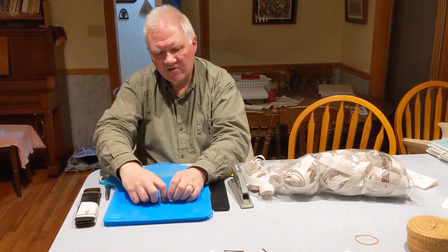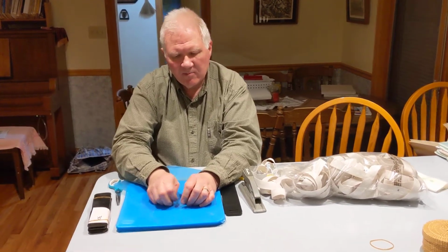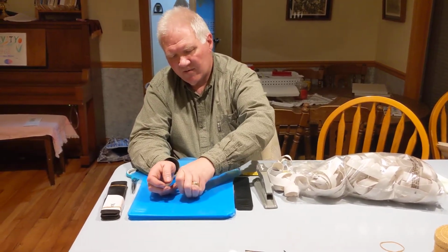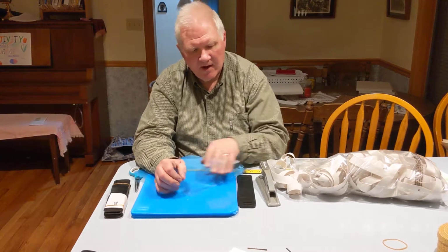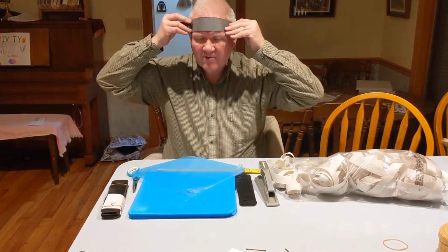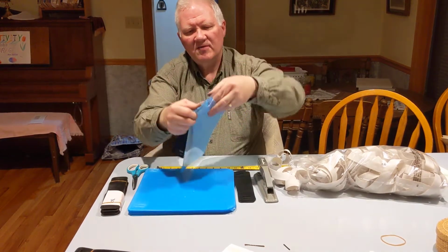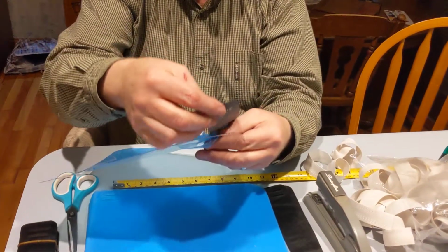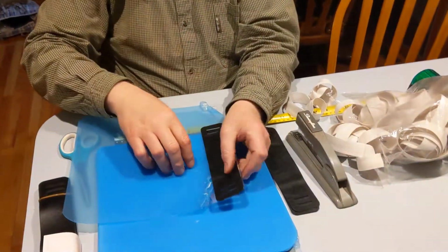So getting those four corners started could be one step of the process, and then the next step will be to assemble with a piece of elastic and a piece of vinyl naugahyde, which acts as a headband. So the headband piece will go with the finished black portion towards the forehead like this. To assemble it to the face shield, separate these and lay them on top of each other so that these slots are aligned with each other.